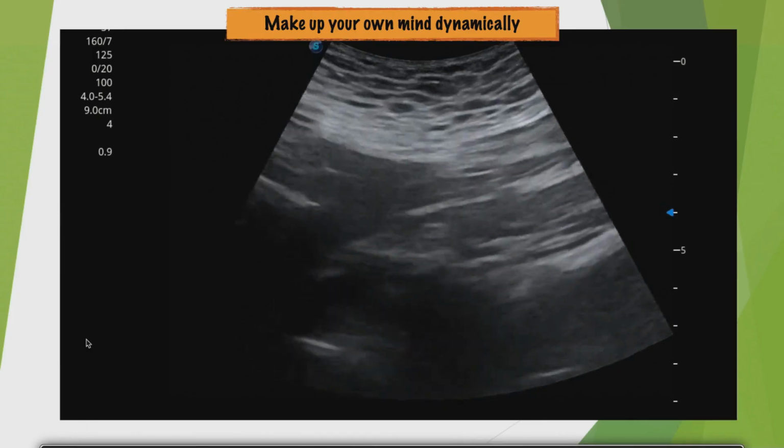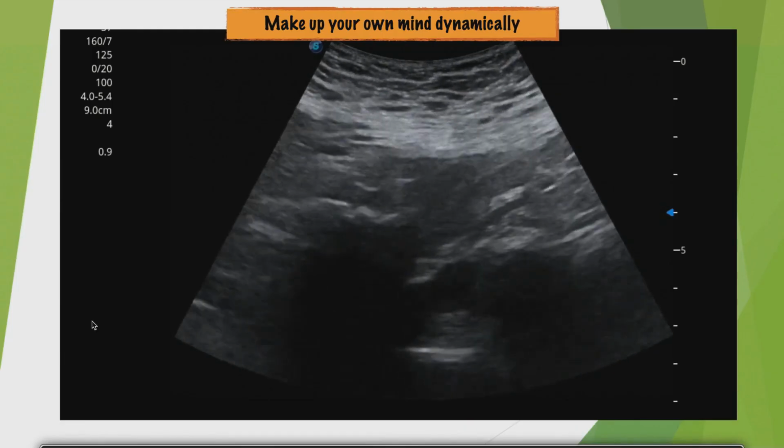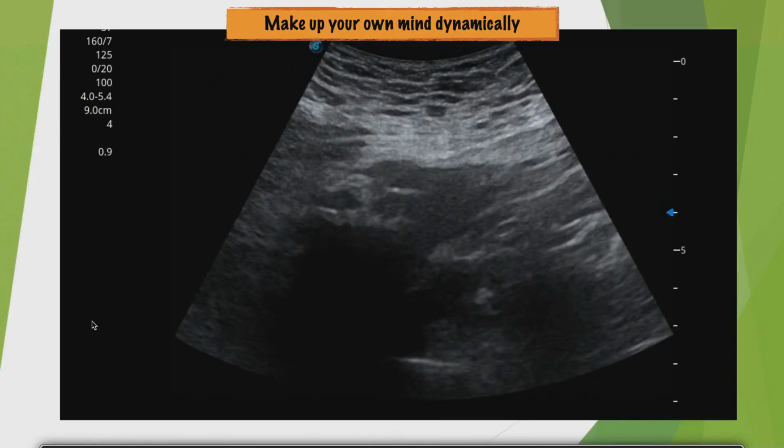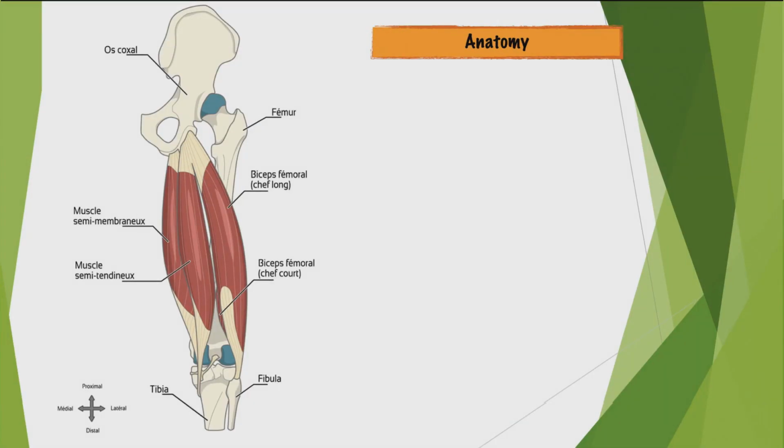So you see, the dynamic, the probe play with the hand, is going to be essential if we're going to be able to pull our weight in difficult diagnoses, difficult patients, or structures like here, complex, deep, because I systematically find the hamstrings, their proximal insertion, extremely difficult to study. Of course, knowing your anatomy will help.